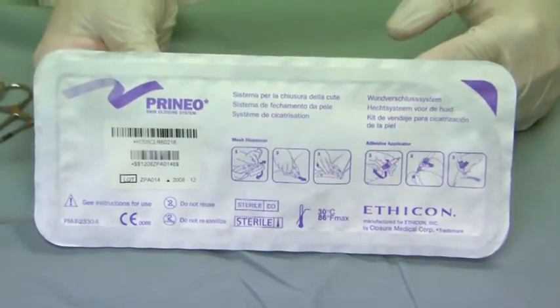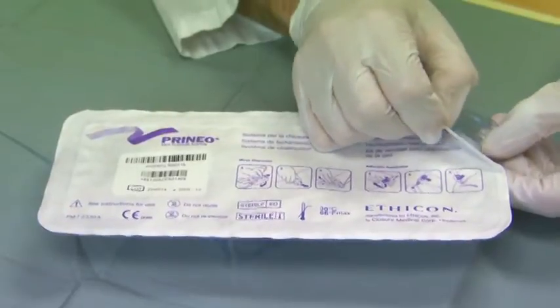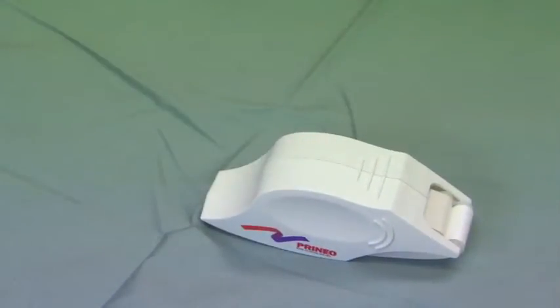The Prineo comes packaged as a sterile two-component item. The first component is a mesh applicator containing 60 centimeters of polyester mesh with a pressure-sensitive adhesive.